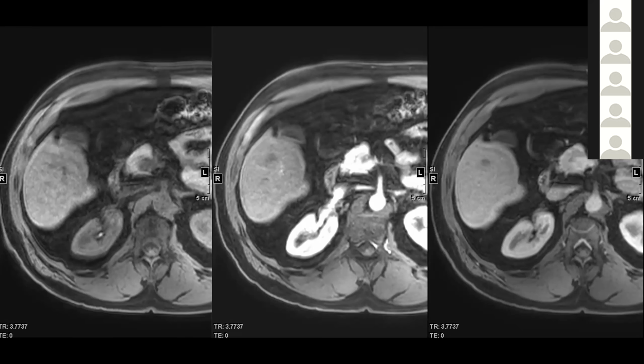It's up for debate, and right now the assessment of all major features for LI-RADS is based on qualitative assessment, so just visually assess it without using quantitative parameters. We don't have yet established quantitative parameters for any features. We also don't have much data on it. I think there's one decent paper that looked at quantitative assessment of washout, and it didn't do any better than qualitative assessment. So all these things are up for discussion. But as of right now, there are no parameters for quantitative assessment, like 10% or 20%. We don't have the data, and we don't have guidance on that. There's just basically visual assessment.